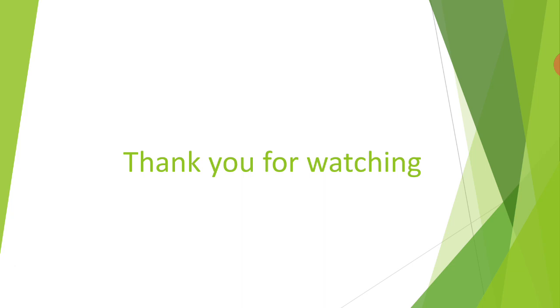So always remember, guys, the difference between when low vision patients first begin to use low vision devices at home, and when you check them in the clinic during examination, is that the illumination is different.